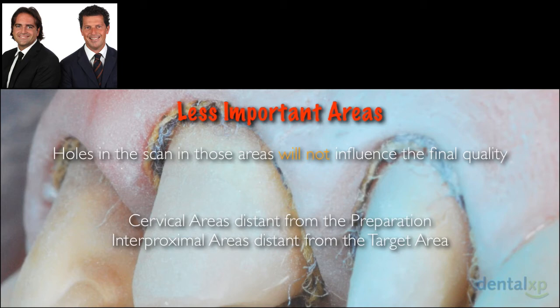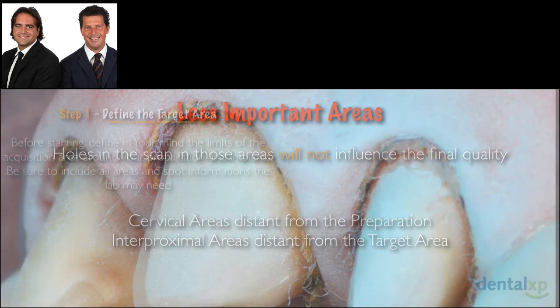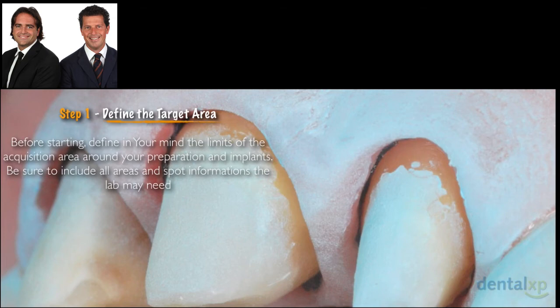For example, the cervical areas distant from the preparation, or the interproximal areas distant from the target area. And before starting our scan, before taking our intraoral scanner in our hand, we have to have a defined protocol in our mind, and we think that this three-step protocol is the most appropriate right now to digitally scan a patient.